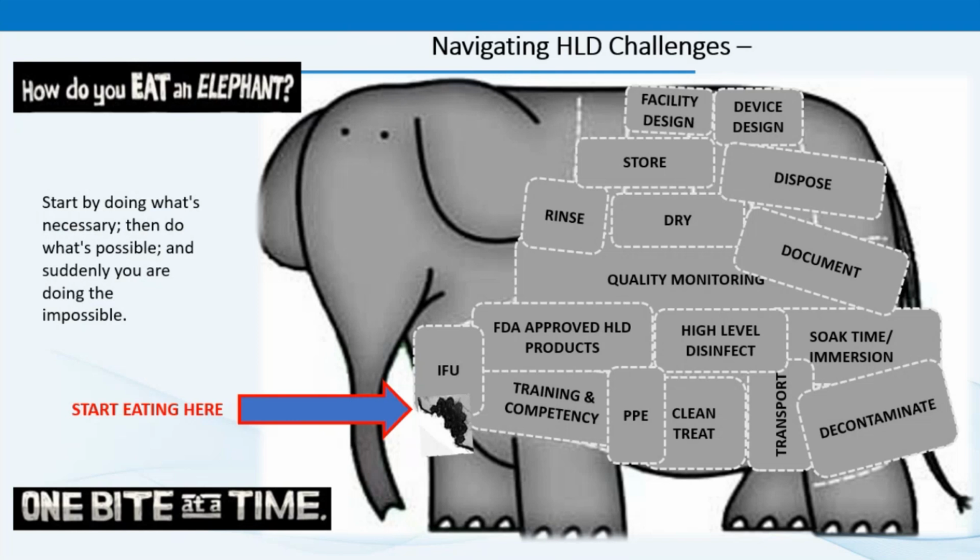For the HLD soak time and immersion, you want to soak that device for the recommended contact time per the IFU. That disinfectant solution is only effective if it can contact all surfaces of a medical device. Completely immerse that device in that disinfectant solution per the IFU and make sure any instruments with lumens or channels are filled with the disinfectant. And once that soaking time starts, no other items can be added.